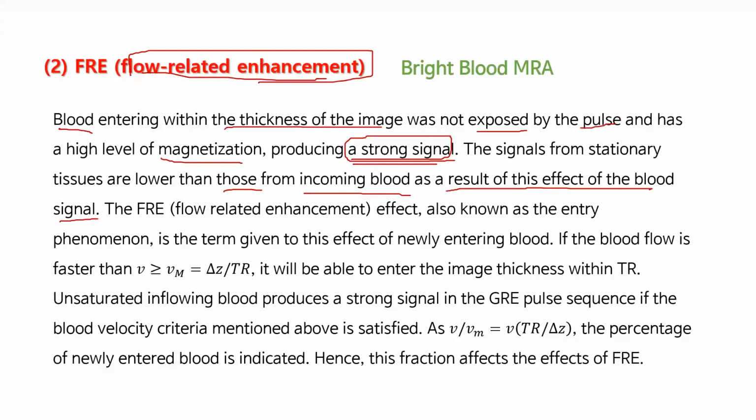So the FRE effect, flow-related enhancement effect, also known as the entry phenomenon, is the term given to this effect of newly entering blood. So this effect is due to newly entering blood. So this FRE effect is also called the entry phenomenon effect.